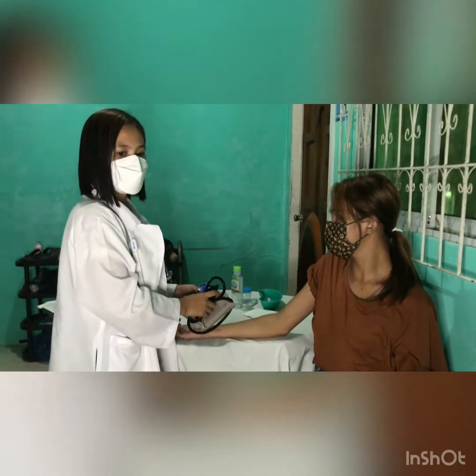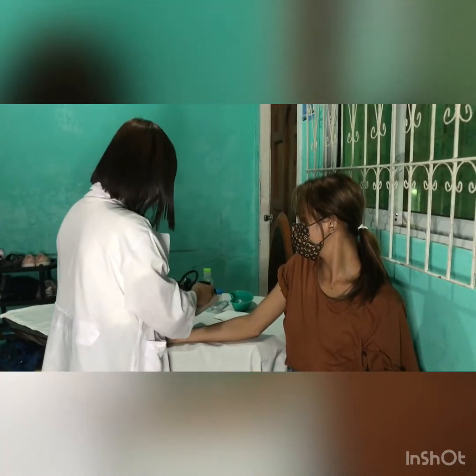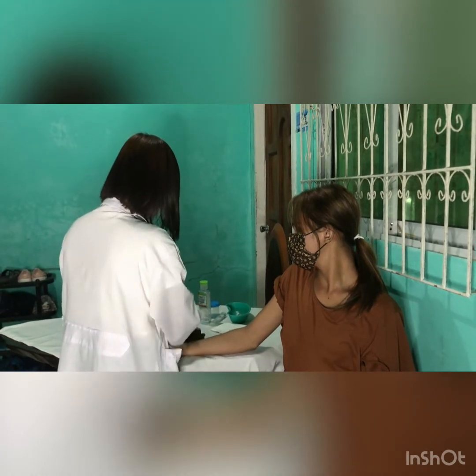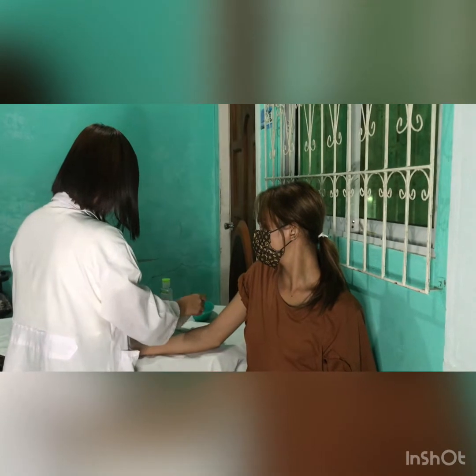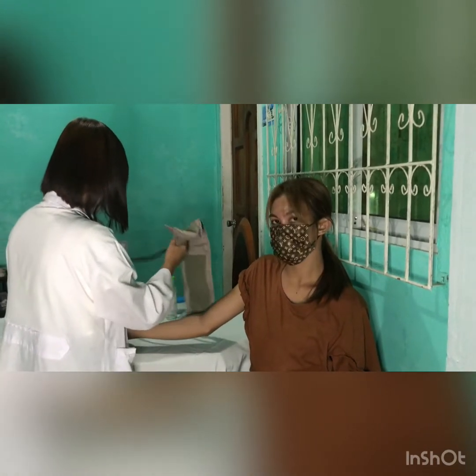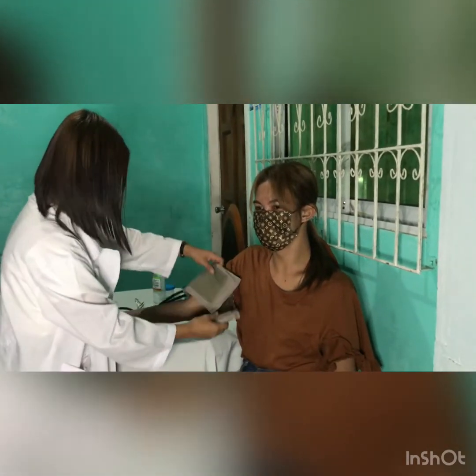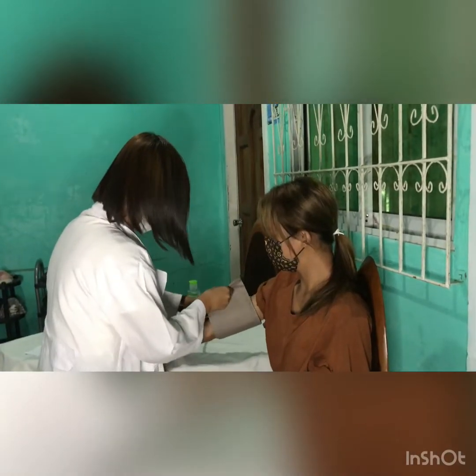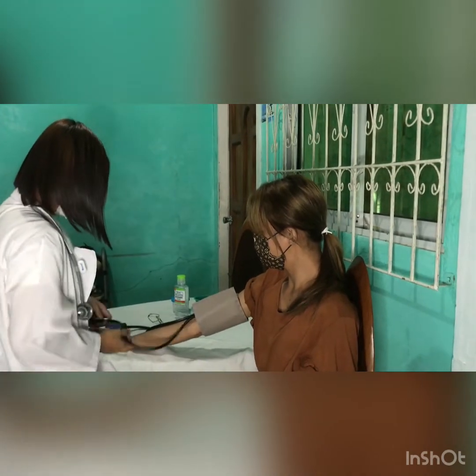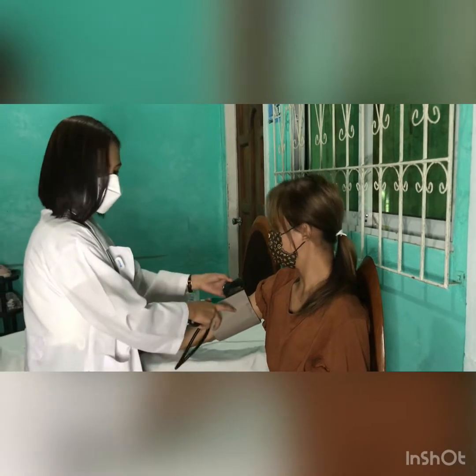Then, ensure the tube is placed in line with the brachial artery.